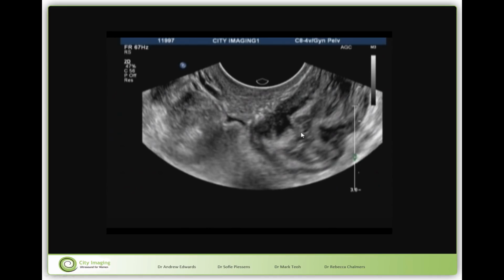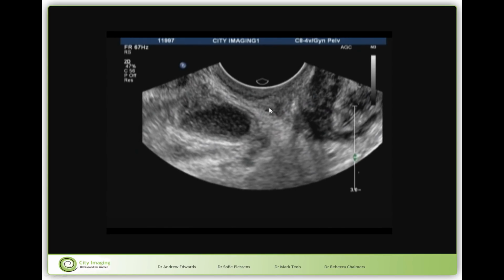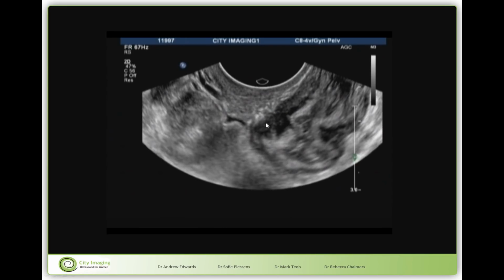So on laparoscopy this will just look like one nodule, but with ultrasound we can actually see the interface between where the vaginal nodule is and where the bowel nodule is, and they are tightly stuck together. So the fact that the bowel is stuck to the posterior vagina makes it very likely that the pouch will not be visible, or at least that there will be partial patchy obliteration by these bowel adhesions to the vagina.